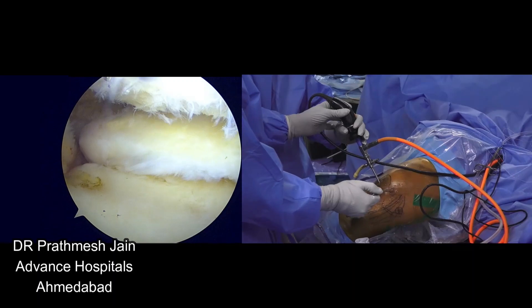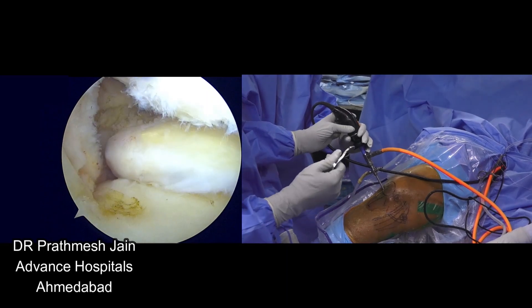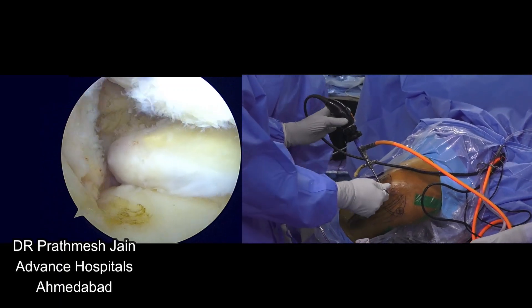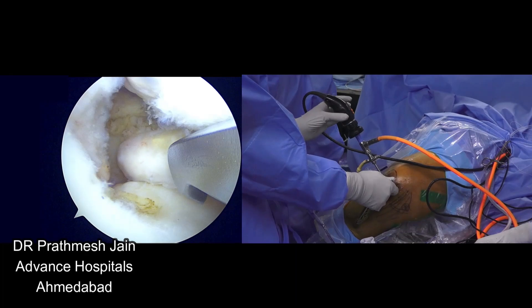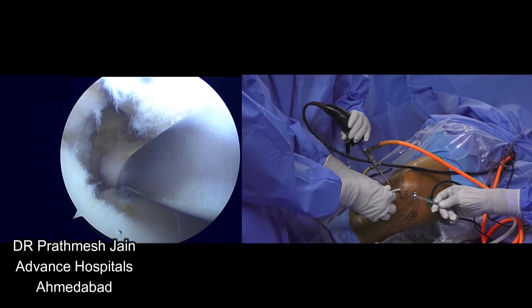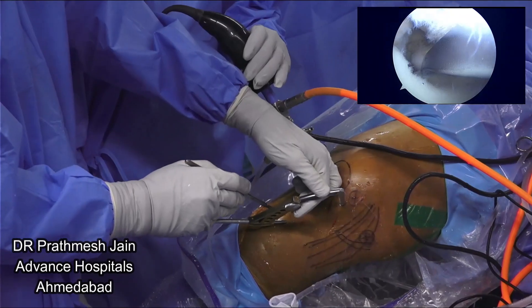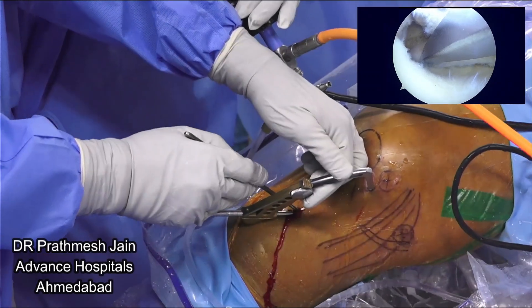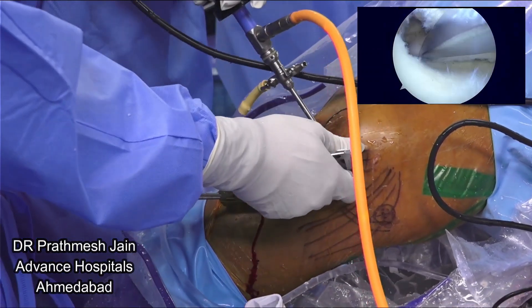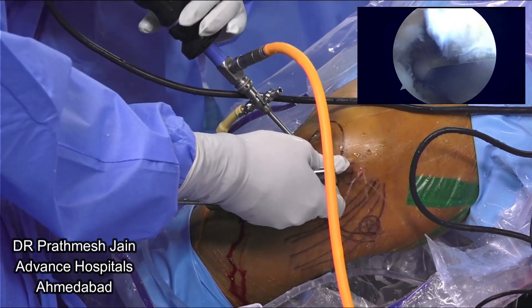Now we are focusing on our meniscus root repair surgery using our root fix retrograde anchor. This is a specialized anchor we have developed for the purposes of root repair. This anchor gives a lot of versatility to the surgeon in repair of the root. It is not only low-profile but versatile — you can use it in very diverse scenarios and circumstances, including side-to-side repairs, and you can use this anchor in radial tear repair as well.